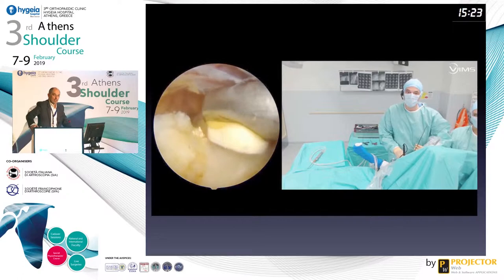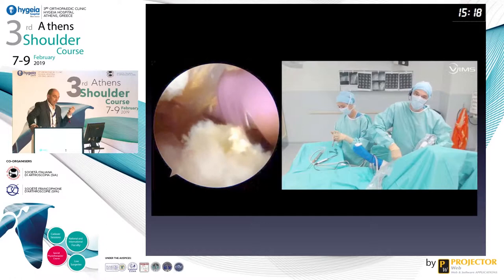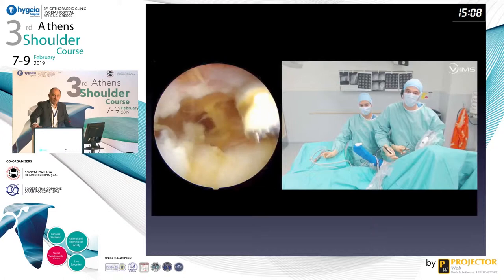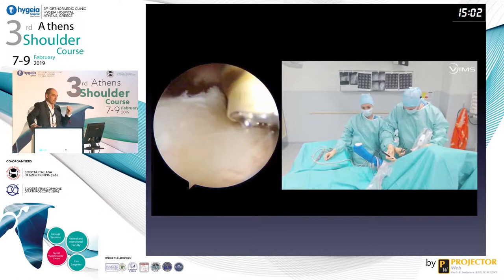This lat dorsi is very thin, in fact, and at this point, it's a very easy dissection, and at this point, you can understand exactly what is the lat dorsi, and under there is an anatomical plane of dissection, and it's very easy at the very beginning of insertion onto the bone to separate both tendons.